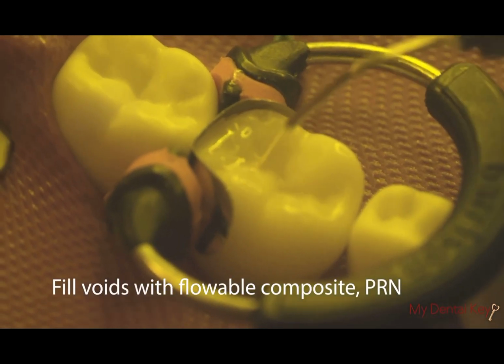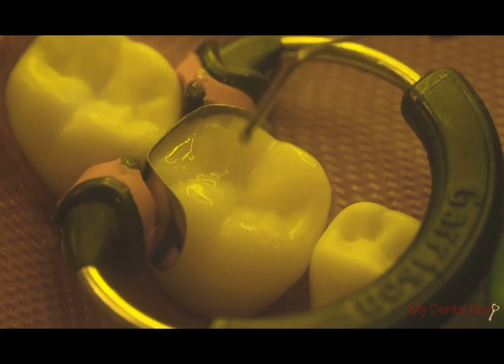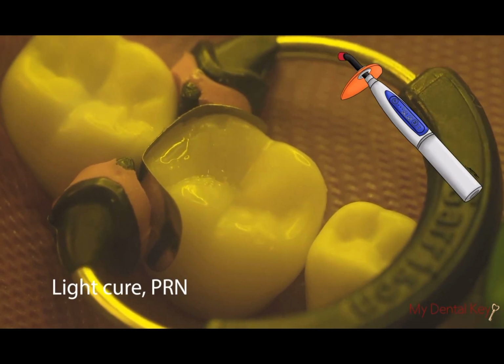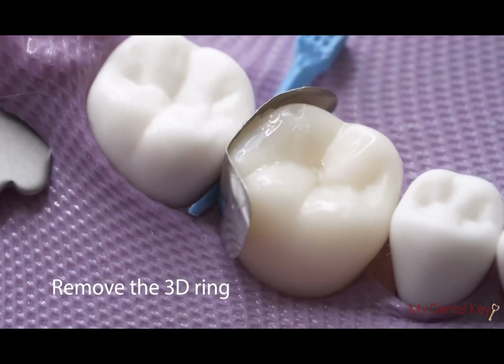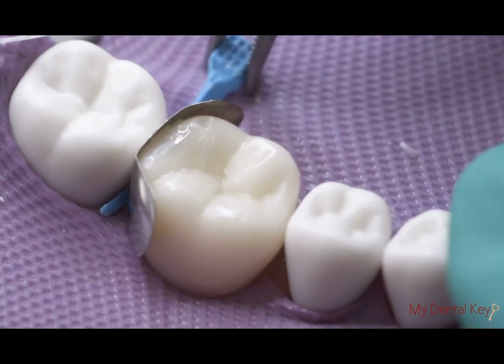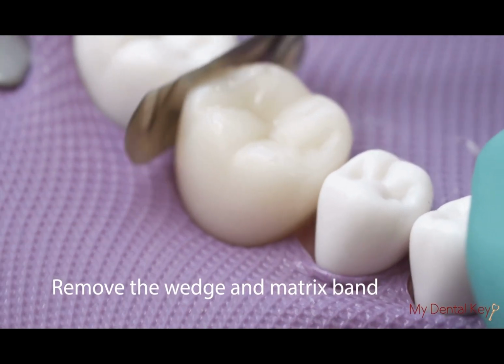As a pro tip, it's helpful to use flowable composite for small voids in your restoration. Light cure after adding flowable composite. Remove the 3D ring with the 3D ring forceps, then remove the wedges, and finally remove your sectional matrix band.